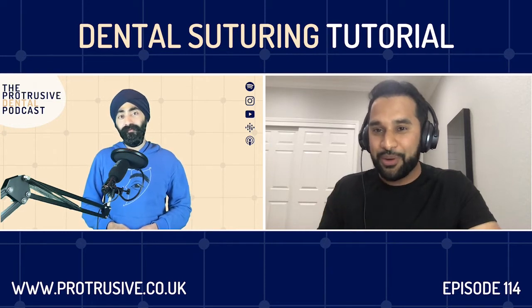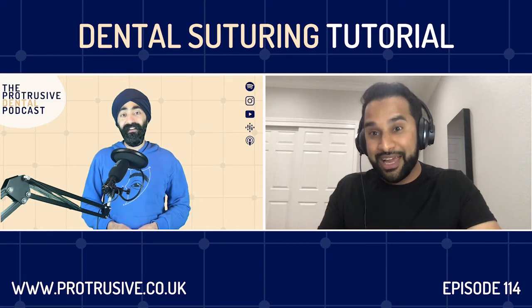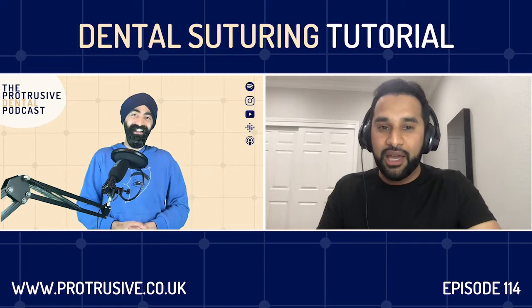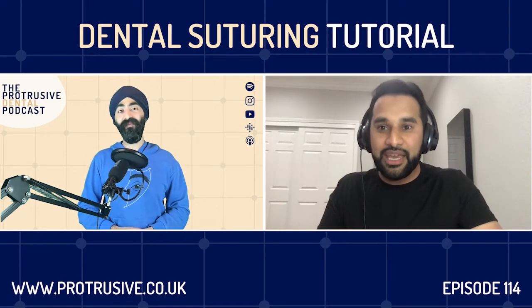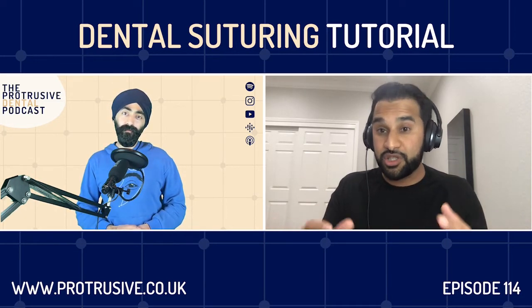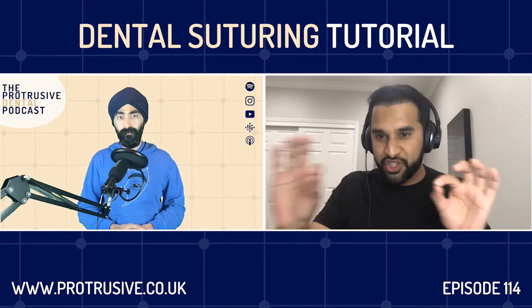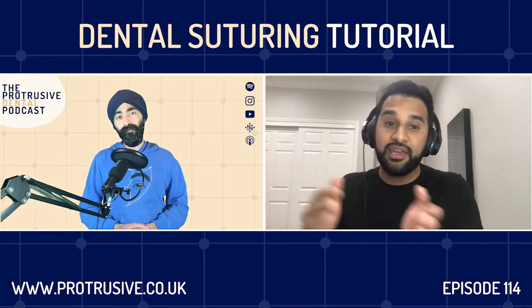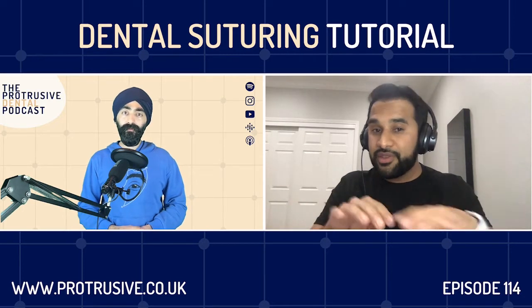I don't want to be in a scenario where I'm saying, it's a great suture, it works in some people's hands, but I just use the same one for everything. I want to be in a position saying I use the best material for the job. And in that case, you have the different categories, which would be braided sutures, non-braided sutures, which is kind of like a twined rope or fishing line, the difference in how the threads are laid out, the synthetic and natural sutures, and then the variances between them.